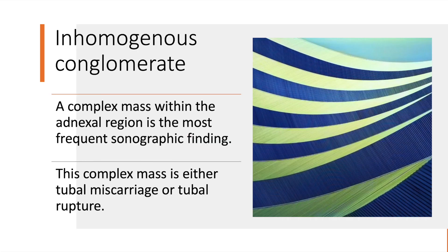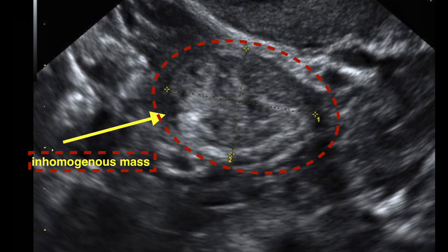The next ultrasound diagnosis is the presence of an inhomogeneous conglomerate, which is nothing but the presence of a complex mass in the adnexal area. As shown in this picture, neither an embryo nor a gestational sac is clearly identified.